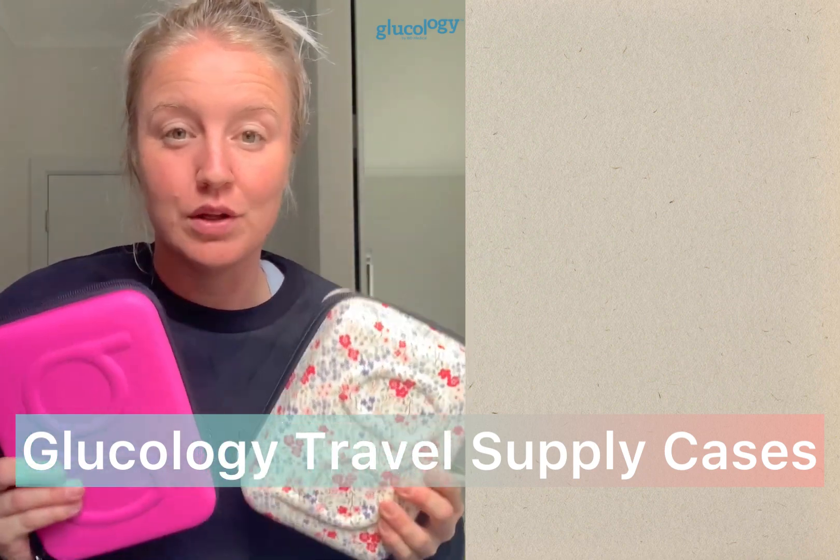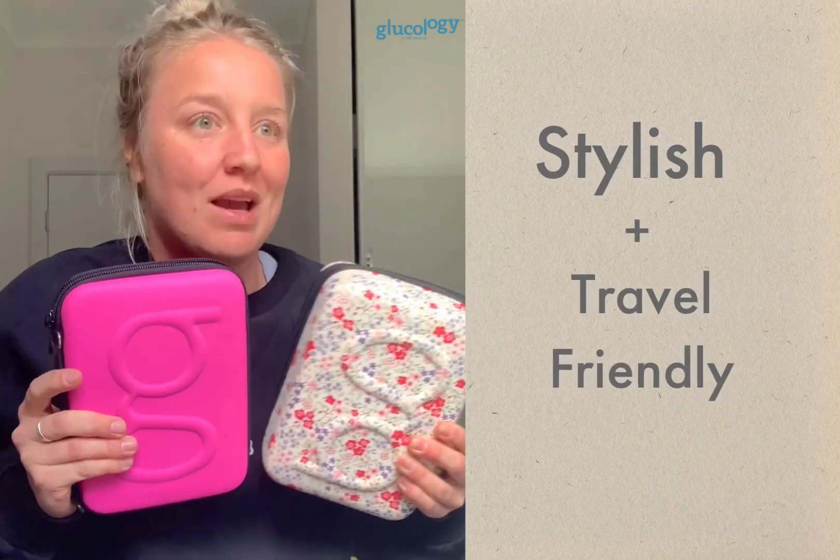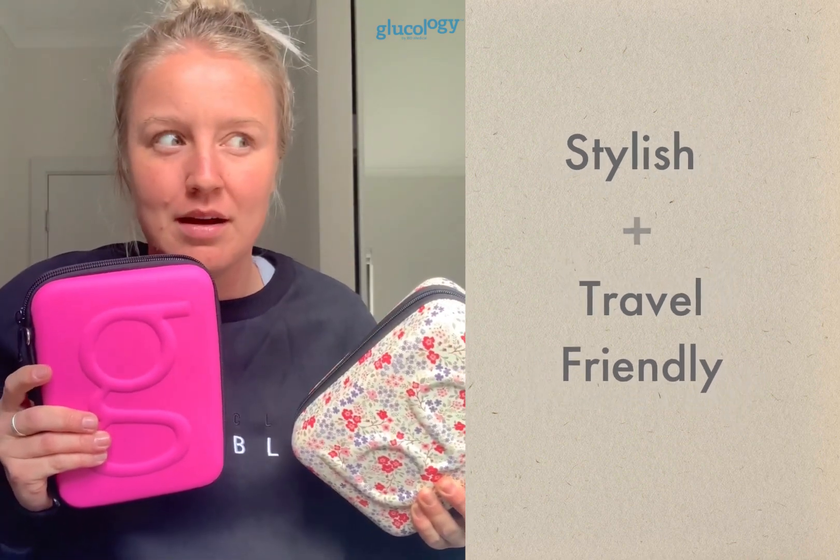I'm here to do a demo video of the differences between the different sized Glucology travel cases. I'm an absolute fan of these cases — they are a complete game-changer, gorgeous, and they've completely changed the way I travel with type 1. Before, I was carrying around crappy little ugly cases. I've tried ones that come with diabetes products like blood sugar meters, and purchased different brands of diabetes cases and wallet bags.